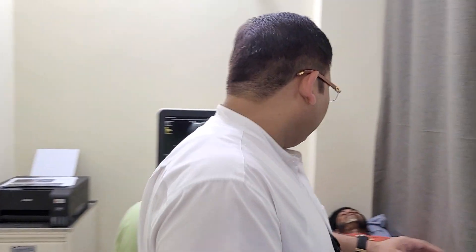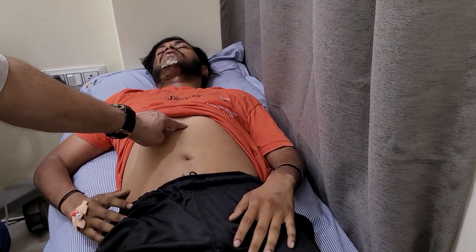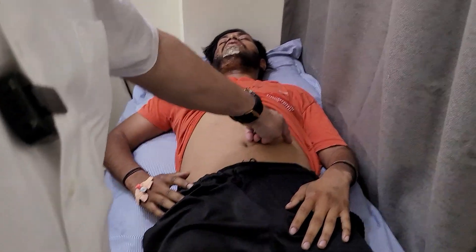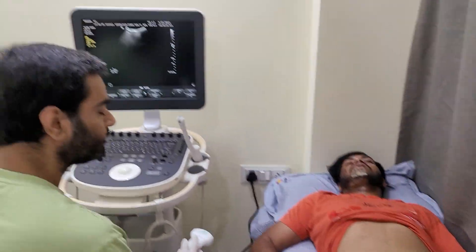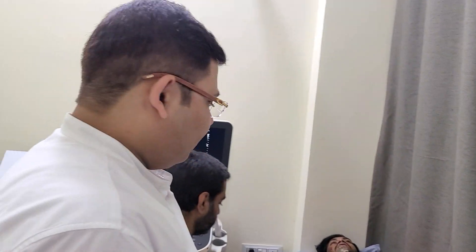We are doing this in our radiology room because the patient is hemodynamically stable. Otherwise, FAST is always done bedside. When we talk about FAST, the four quadrants we will be looking at are: the sub-xiphoid, then we have HRP, SRP, and Pouch of Douglas. Now we will be showing you how the assessment is done.